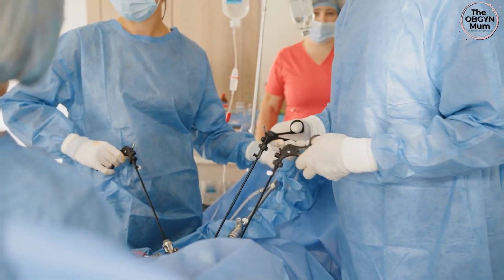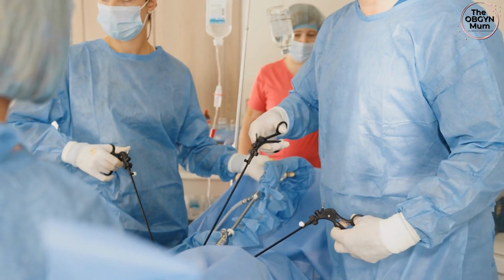Then a port is a small plastic tube that allows the instruments that are required for the operation to be inserted into the abdomen, and they'll then be placed. Sometimes more than one port is needed. It's common to wake up and you've got 3 or 4 incisions where the ports have been placed. After the procedure, the gas is then released from your abdomen and we use stitches or glue to close those incisions over. Dressings are then usually placed over these wounds.